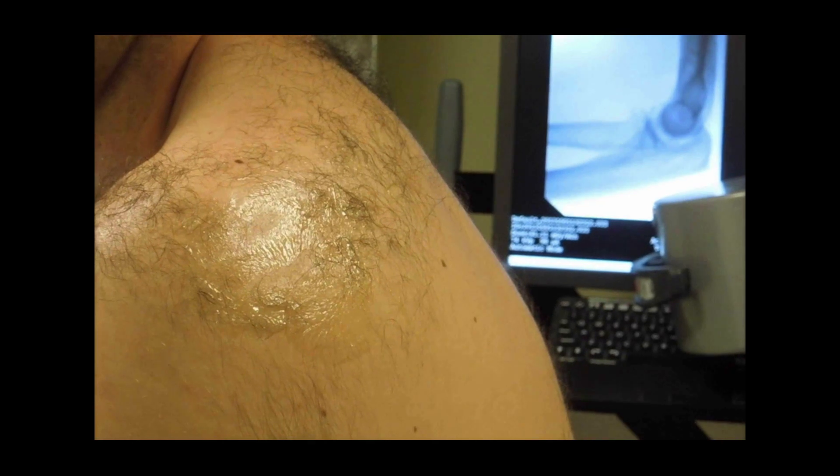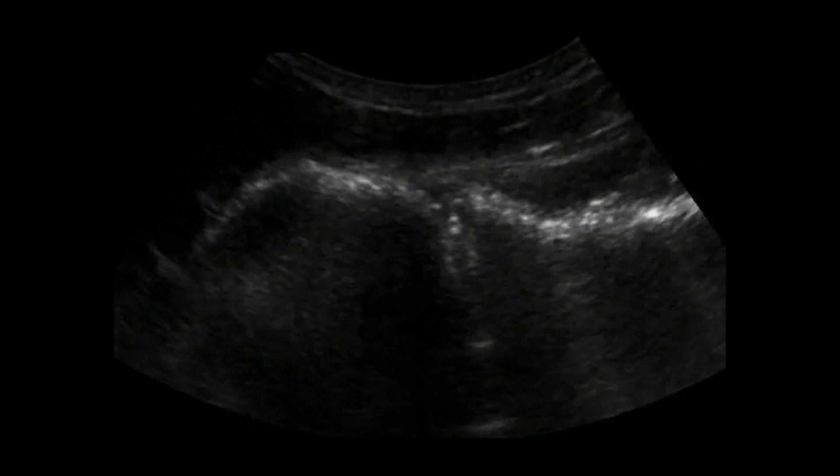The corresponding ultrasound image created can be seen here. Remember that the area that is closest to you on your screen is actually the back of the patient, so you are looking forward, you are looking towards the front of the patient. Here's your scapular spine. Notice the hyperechoic rim of the spine and the shadowing beyond it.